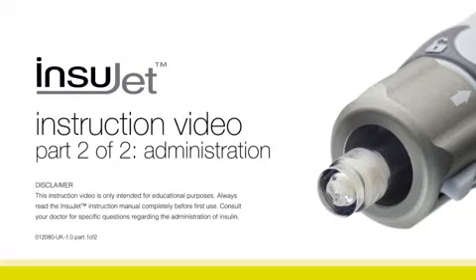You have chosen the Insujet for insulin administration. During the course of this video, we'll explain step by step how to use the Insujet. In case you're using the Insujet for the first time, watch the video demonstrating the preparatory steps first.